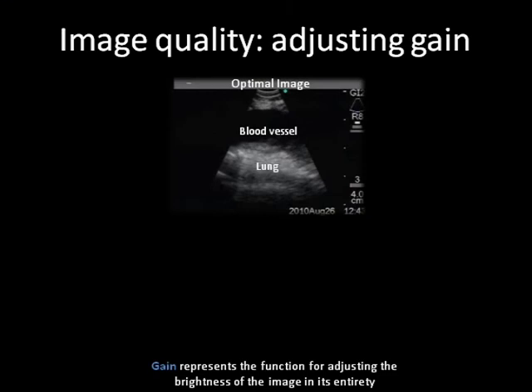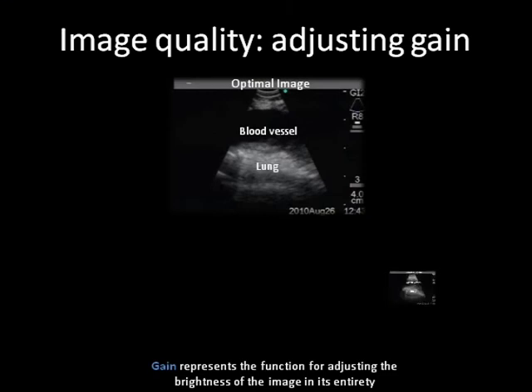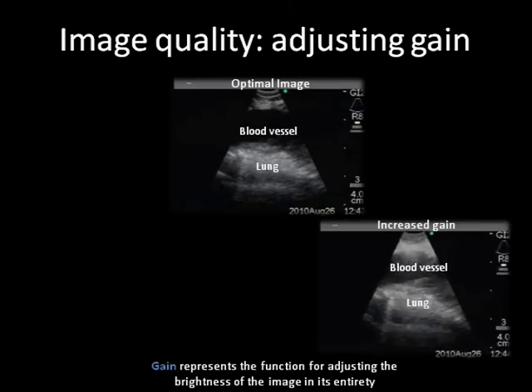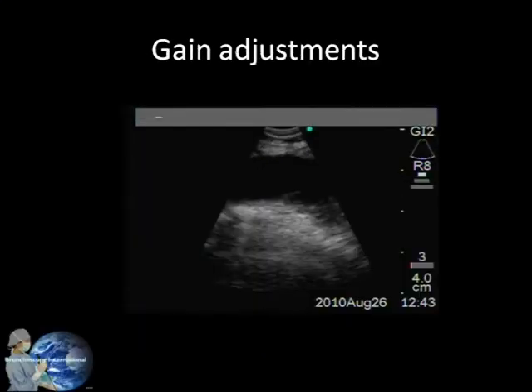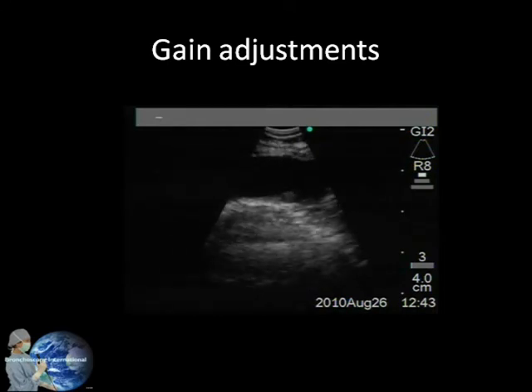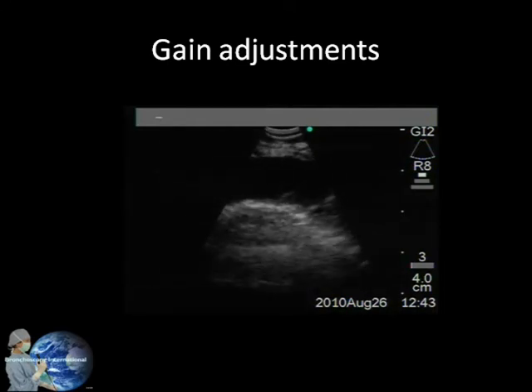Changing gain makes the whole image brighter or darker. The loss in amplitude that occurs as the ultrasound signal propagates through tissues is corrected by amplifying the signal proportional to the depth from which the signal came. Here is an example of gain adjustments.